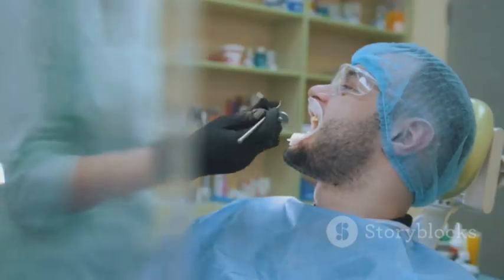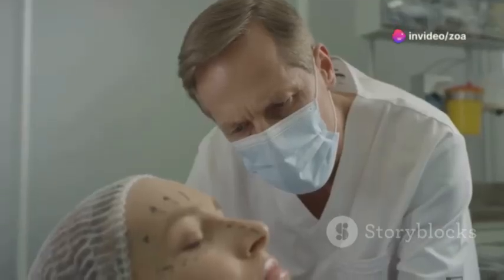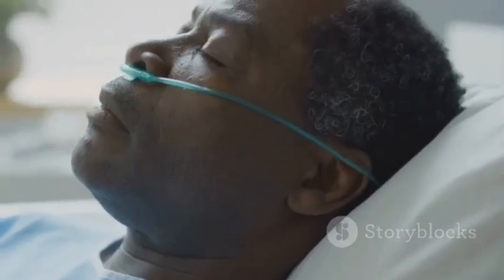Nasal intubation is often preferred in situations where oral intubation is difficult or impossible. This includes patients with limited mouth opening, facial trauma, or specific anatomical variations. Additionally, it allows for better patient comfort and tolerance, particularly in long-term ventilation.